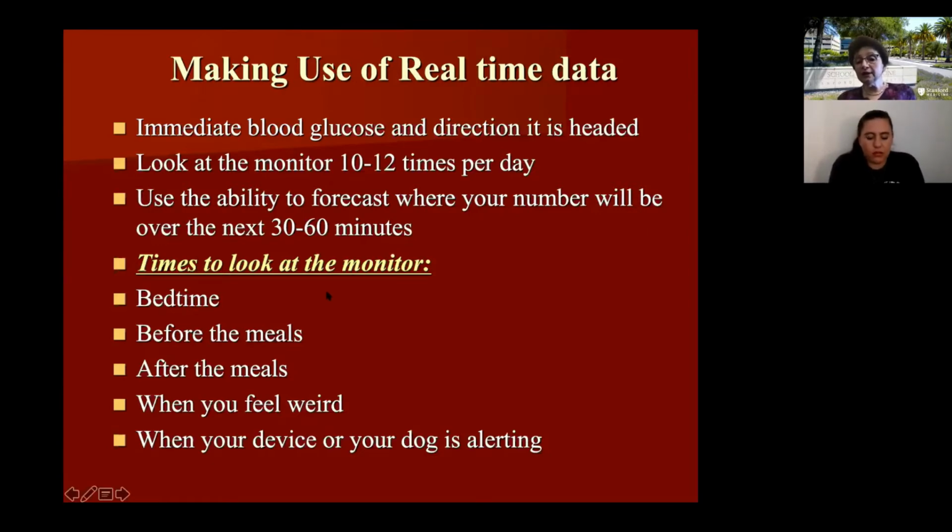Do you need to maybe give yourself a bolus earlier and wait till the arrows go straight before you add more carbs? Because if your numbers are already going up for whatever reason, stress or being sick or maybe some leftover from the previous snack, not getting enough bolus, then just wait maybe 10, 15 minutes. Or if you're super hungry, then start eating, but start with the protein and not with the carbs, so as not to exacerbate it.